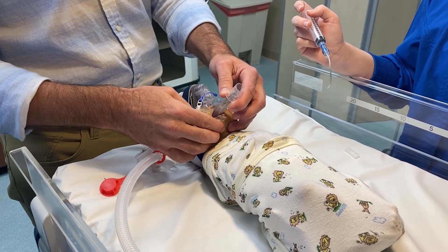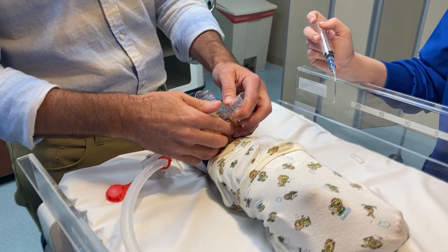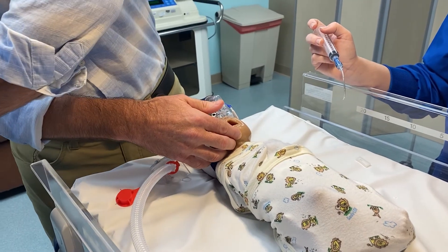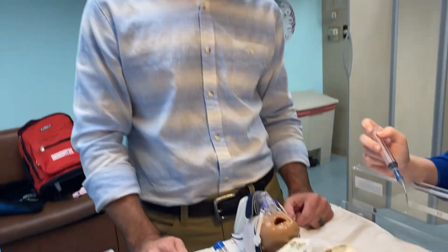Before you pull the device, make sure you have suction hooked up. Occasionally you may have some surfactant come out of the baby's mouth, just as can happen sometimes with an endotracheal tube. Once the device is pulled, the baby is stabilized and on CPAP, and has received their dose of surfactant in a minimally invasive way using this technique.